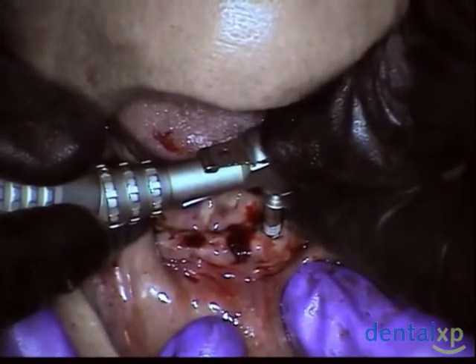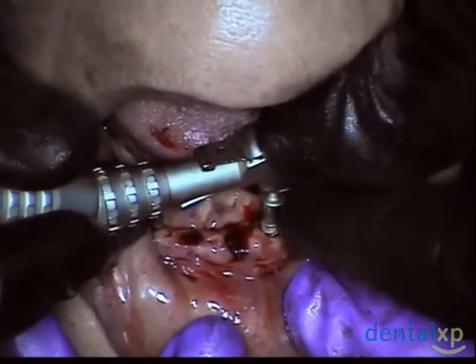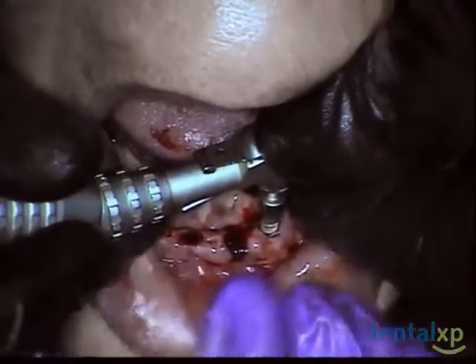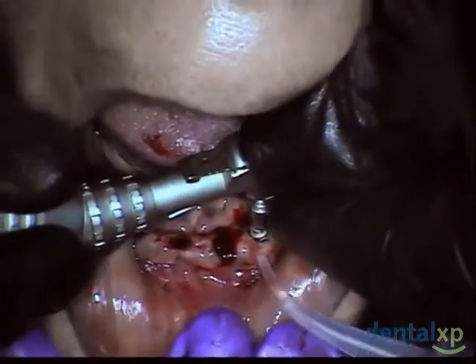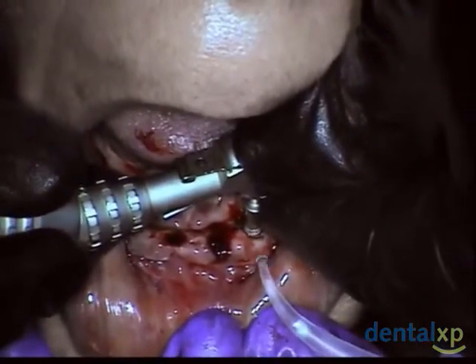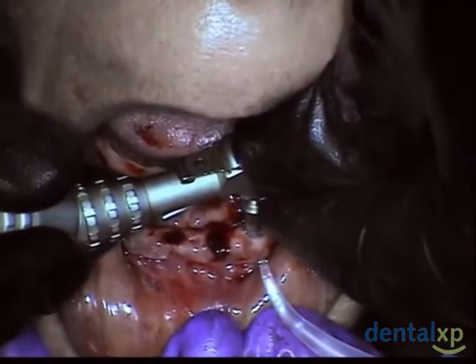And you see we're going very slow, and I'll have my assistant intermittently inject some water in this area, or some saline, since we want to keep it cool. I don't want to have it coming on as strong as I did before, because if I do, right there, what happens there is the patient ends up drowning.